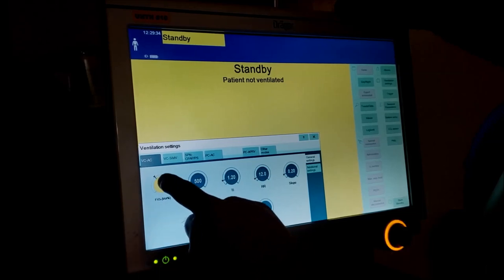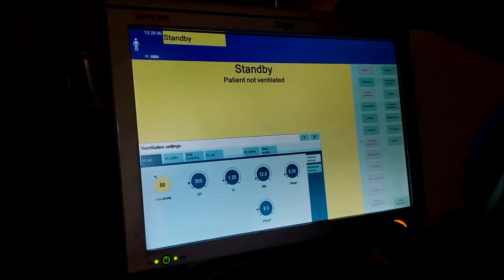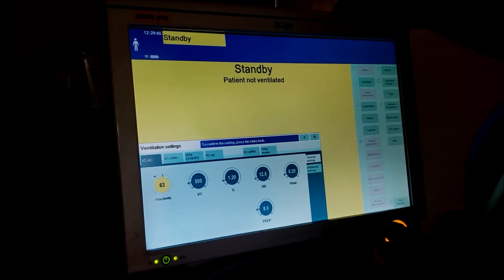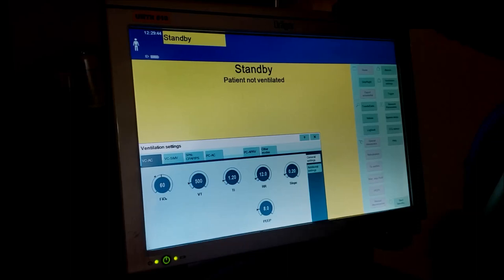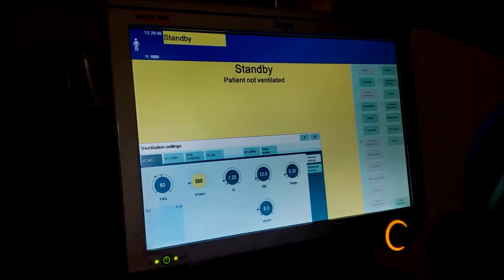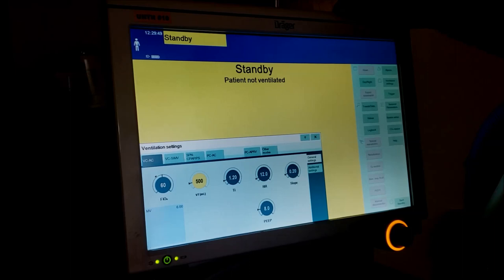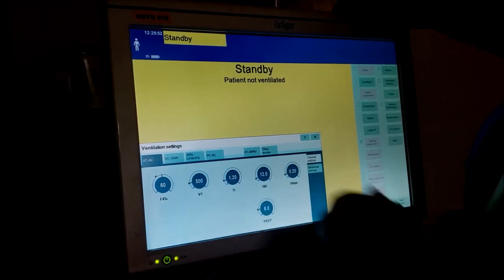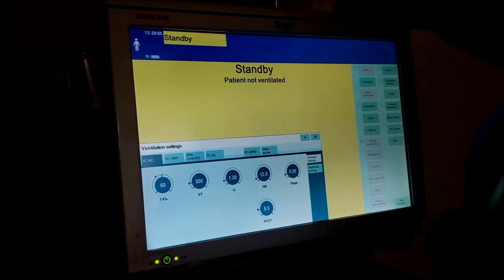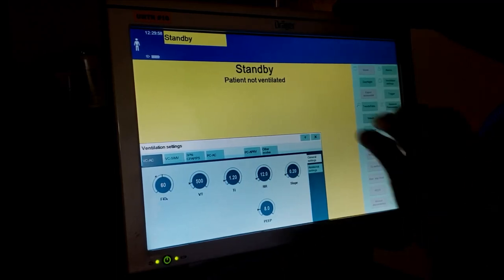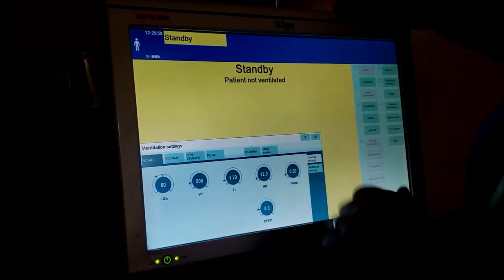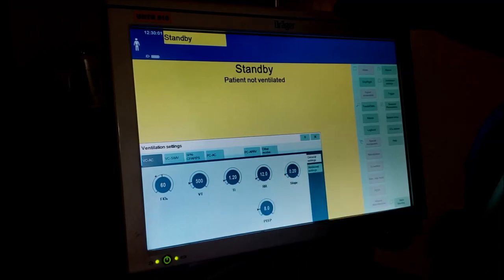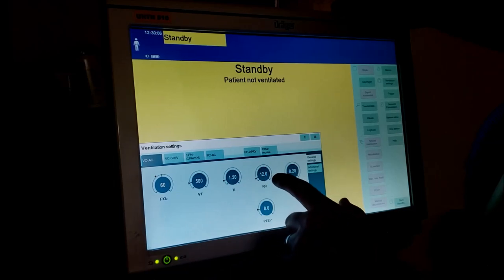We have FiO2. If we want to start at something different, we touch, adjust here, and confirm by hitting the button. Let's just go with 60%, hit the button. Tidal volume - this is in milliliters. The goal is really 8 to 10 milliliters per kilogram ideal body weight, generically 500. TI - that's inspiratory time, don't worry about that much. That's gonna vary because this is an auto flow device. We leave it at 1.2. The patient can actually do what they want on their own - that's the beauty of this device.